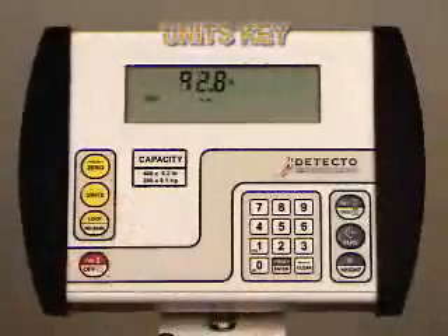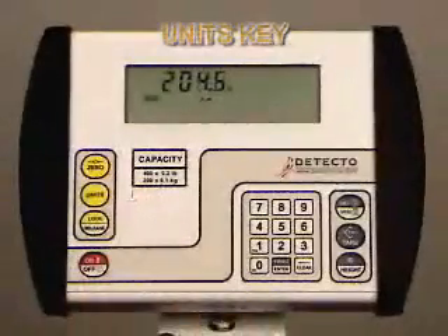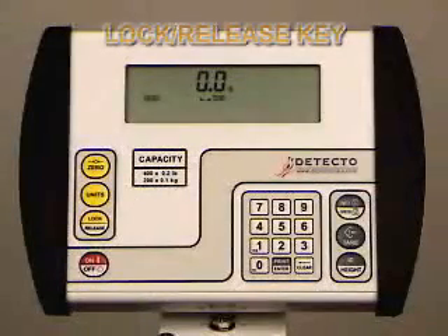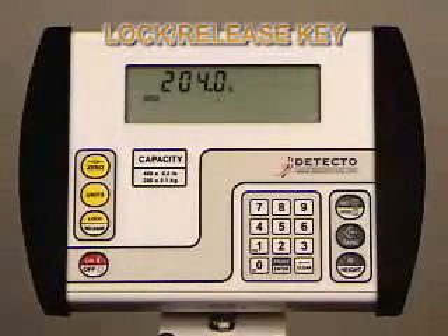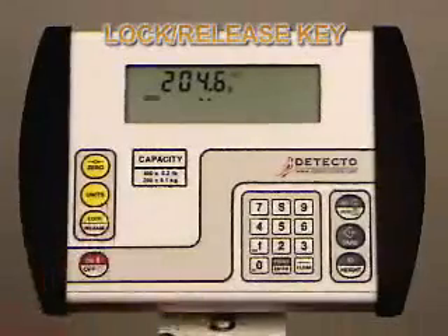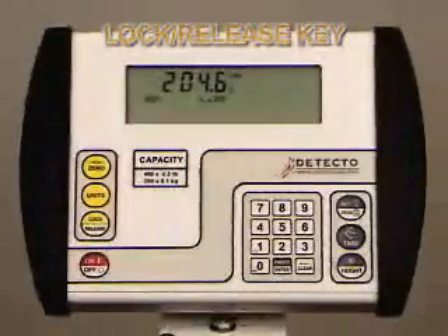To toggle units from pounds to kilograms, push the units key. To return to pounds, simply push the units key again. The third yellow quick key is lock release, which is used to lock and unlock the display. With the patient on the scale and a stable indication, press the lock release key. The lock indicator will come on, and even after the patient has stepped off the scale, the weight is locked in. Pressing the key a second time will unlock the display and return the weight display to zero.